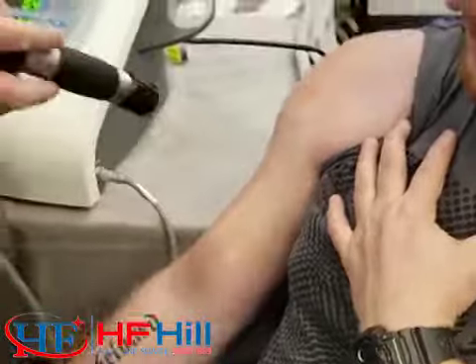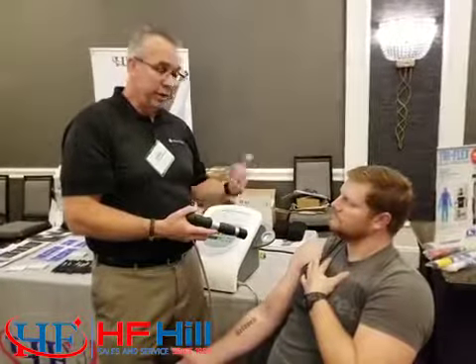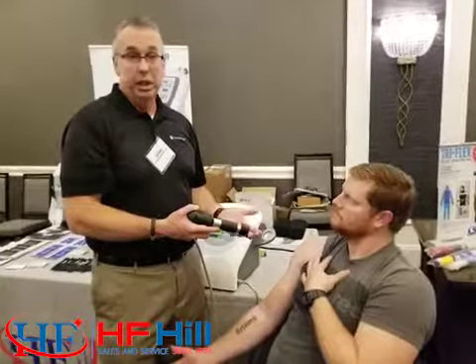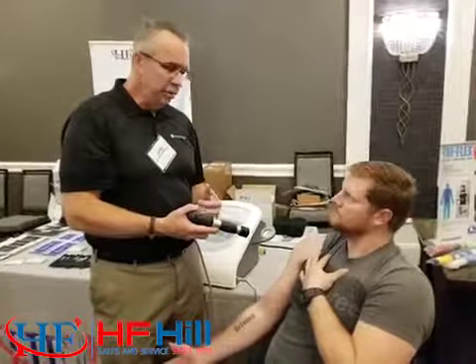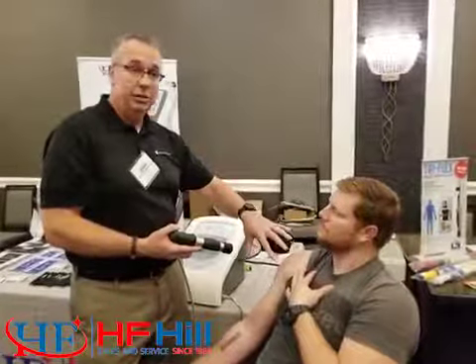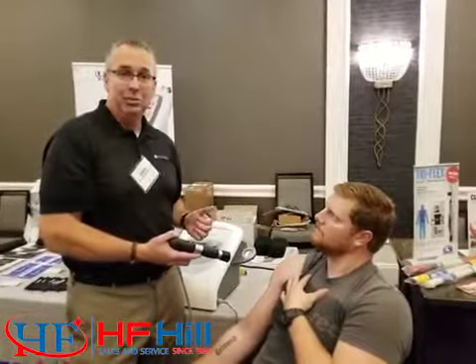You can work it very similar to as if you were doing some of your other soft tissue mobilization techniques. The biggest difference is it has a much greater depth of penetration. So it's a little bit easier on people as far as their technique goes. And you can use it again while performing range of motion and things like that. But where it really shines is getting into those areas, or as I like to say, it gets to the itch that we just really can't scratch.